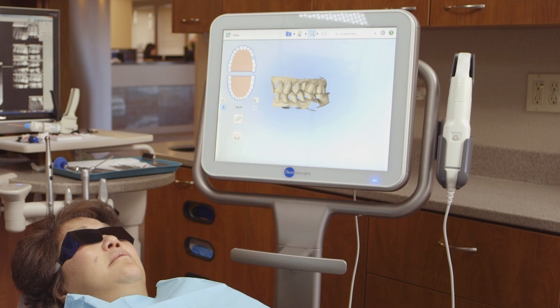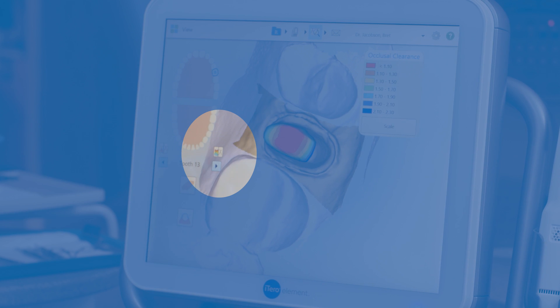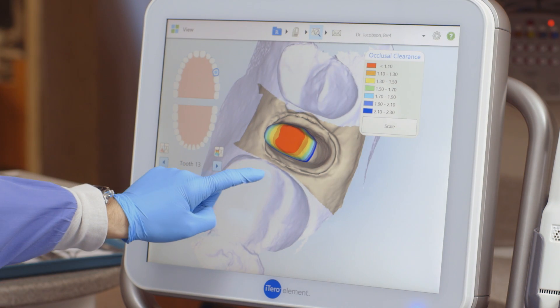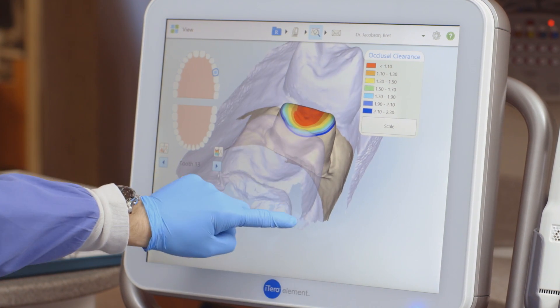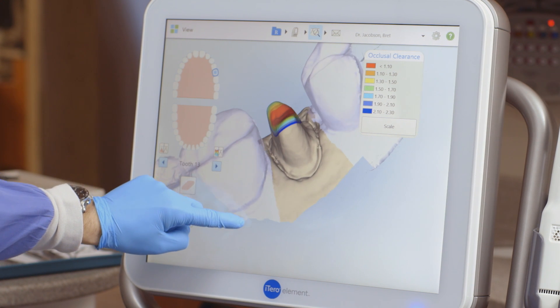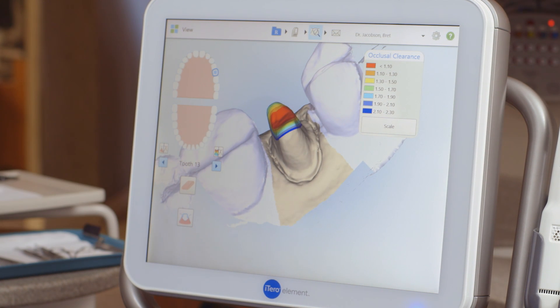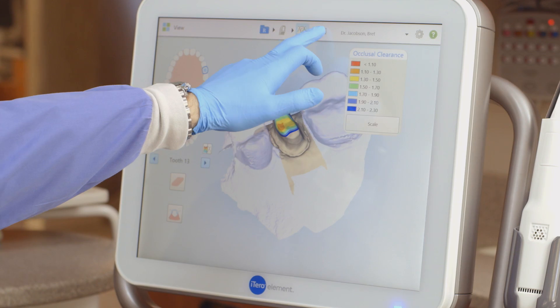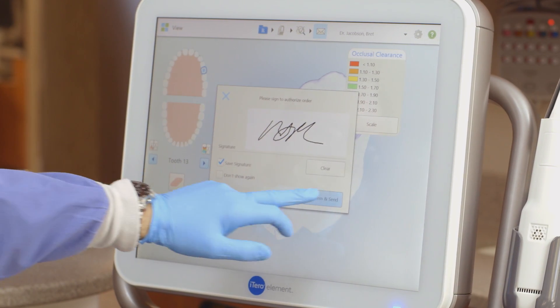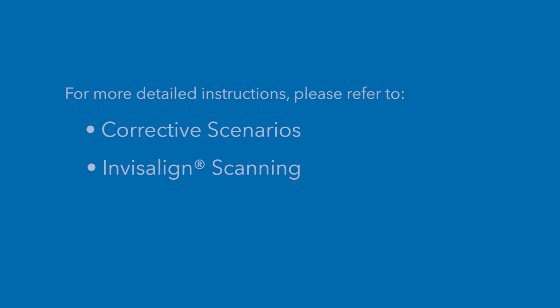In the bite segment, I will check the occlusal clearance by tapping on the occlusal clearance icon. A color map appears to show me how much occlusal reduction is present. The color map coordinates with the legend. If there isn't enough clearance for the restoration, I will use the eraser tool to adjust the occlusion. Please refer to the corrective scenarios video for a detailed demonstration. When I'm satisfied with the digital model, I will send the case. For more detailed instructions, please refer to the corrective scenarios and Invisalign scanning videos.